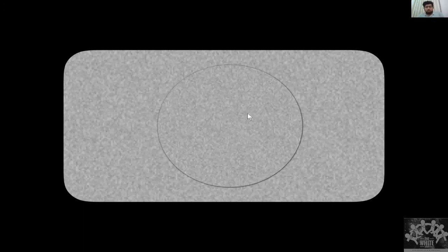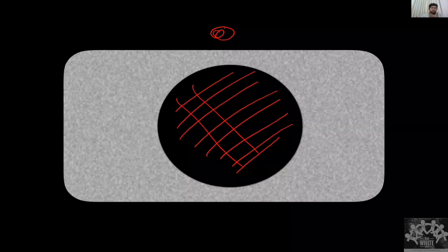Okay. So sometimes it will be appearing completely black. That means that we have not received any echo. Whenever we receive any information, it becomes a little bright. But if I am receiving more and more reflected sound, it will become brighter and brighter.